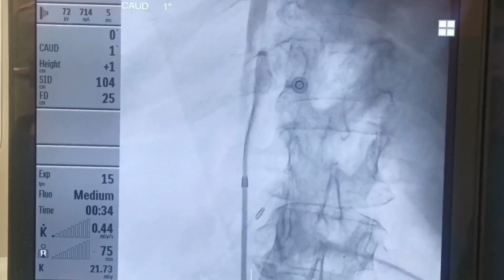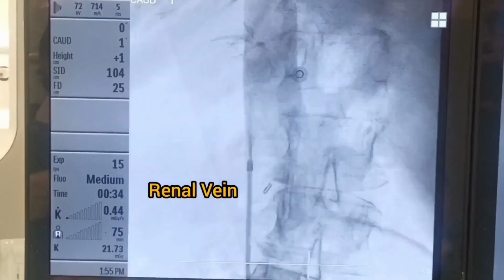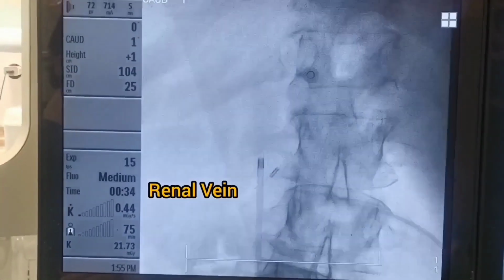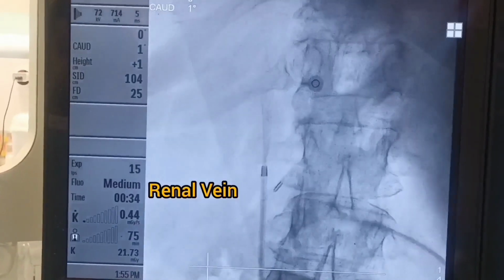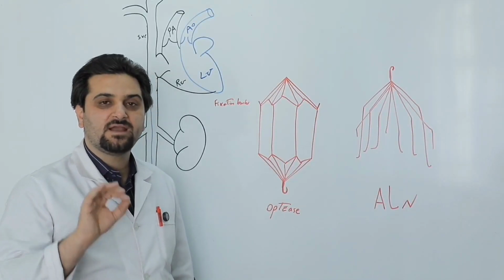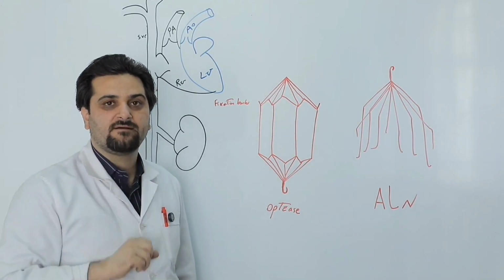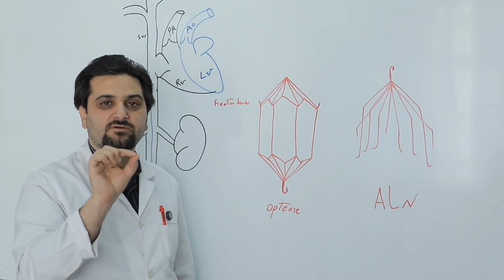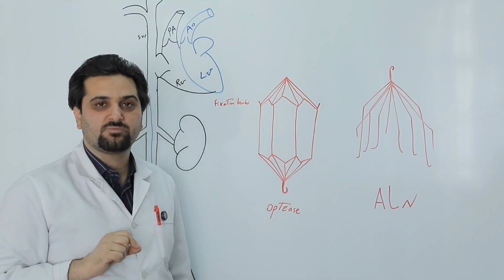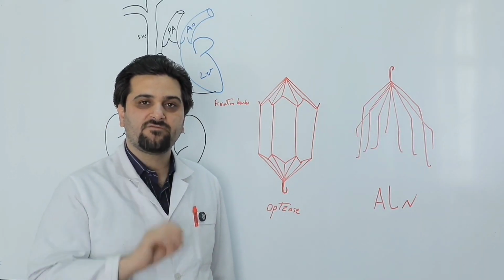Well, as you can see, after we injected into the IVC, the two main branches of the renal vein became visible, and the contrast agent is washed out, meaning it is cleared away by the blood returning from the renal vein. Now, anatomically, how do we determine the location of the renal vein? Based on the shadow of the vertebrae, the renal vein is located at the level of the L1 and L2 vertebrae, and the bifurcation of the IVC is at the level of the L5 vertebra.